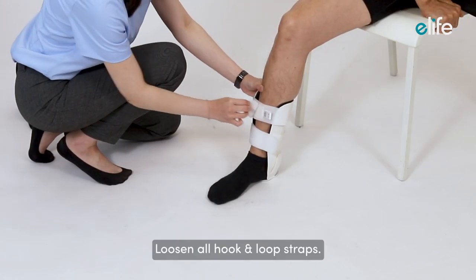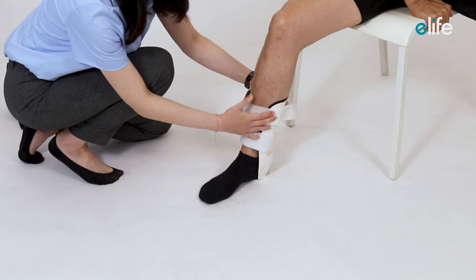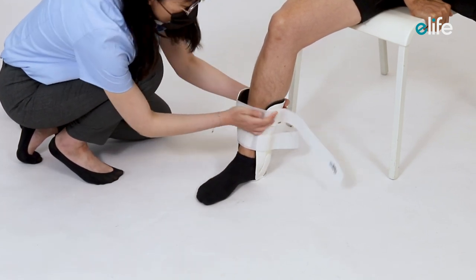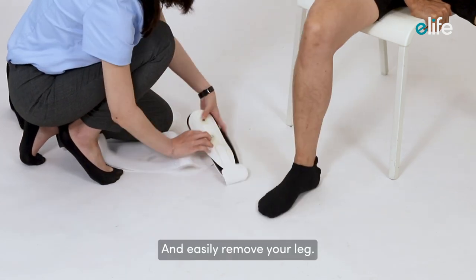To remove the brace, loosen all hook and loop straps, and easily remove your leg.